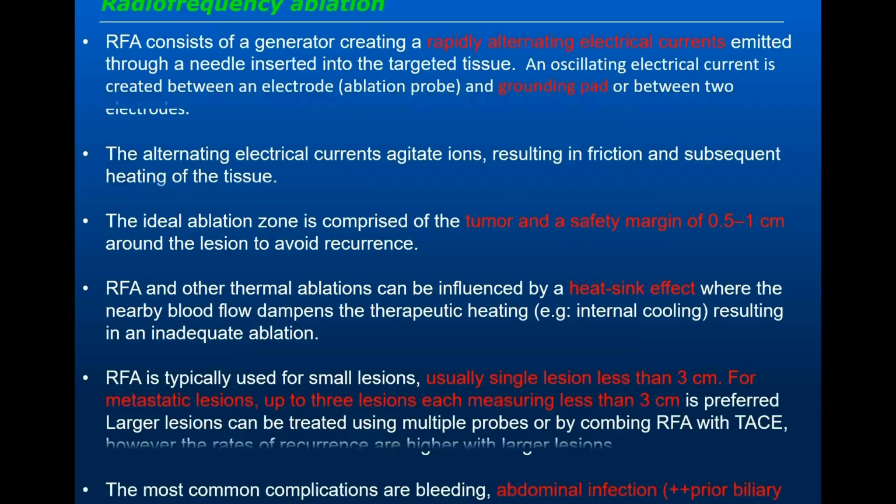So let's talk about radiofrequency ablation. I know this is a busy slide, I apologize, but it's really not as busy as you think. I will try to simplify again. I know this is for medical students, but the information that you will hear in this lecture will be very important if you decide to go for shadowing or work in an environment where they are heavy in IO. This will really give you a good fund of knowledge so that you can even go into deep discussions.